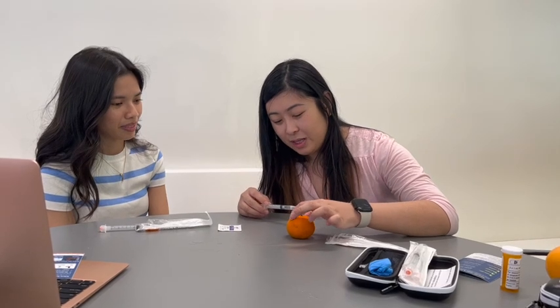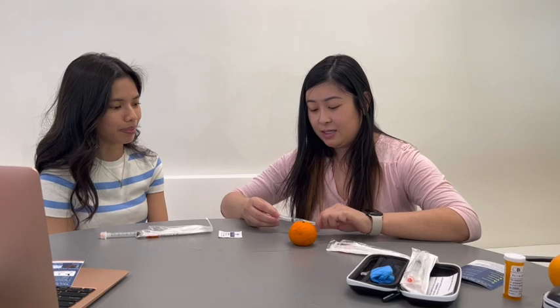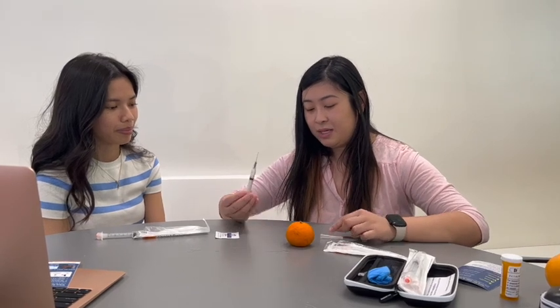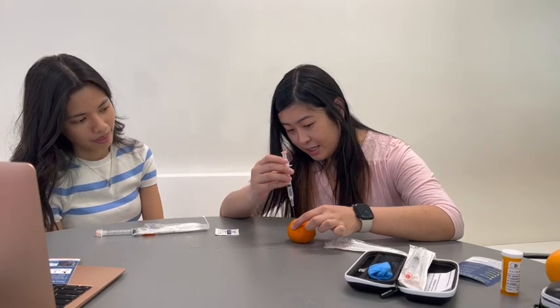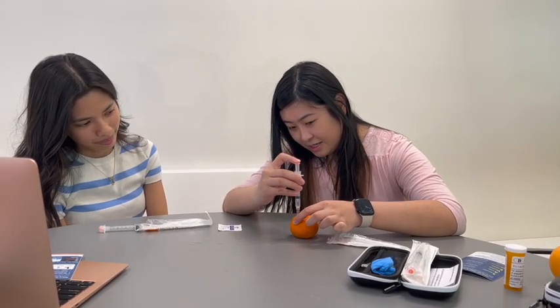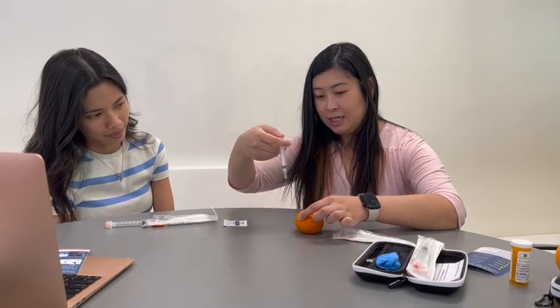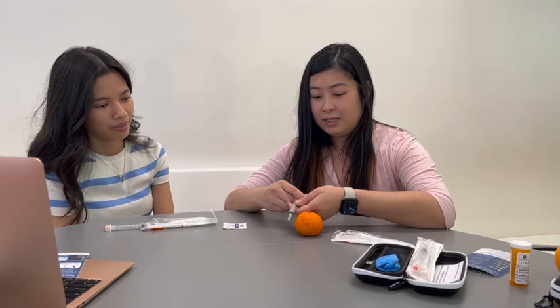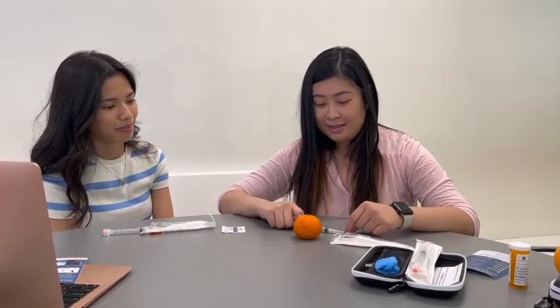So locate the area. Let's say this is the upper arm. I'm gonna do it. So uncap the syringe with the naloxone, and then you said 90-degree. So right here, I'm gonna push it in, and then inject the medication in there. And then once that's done, I can press it to engage the safety cap so I don't poke anyone. And that's it. Okay, good job.